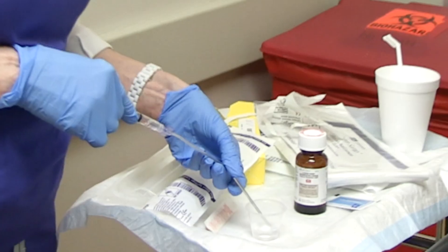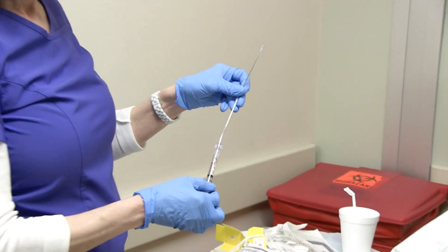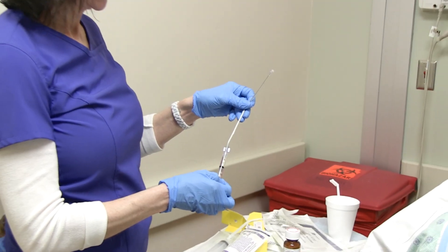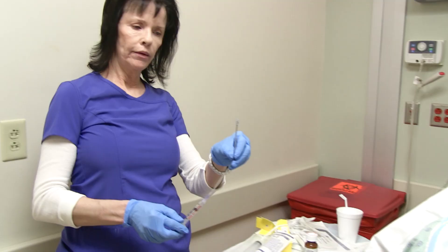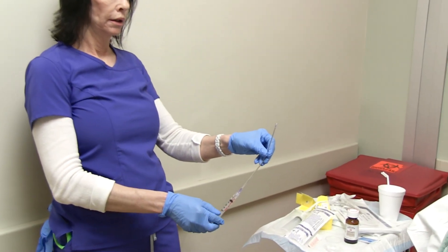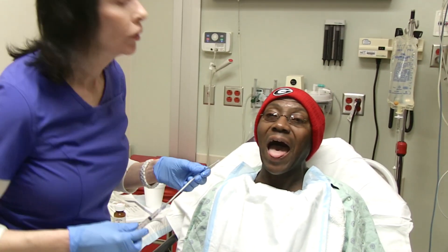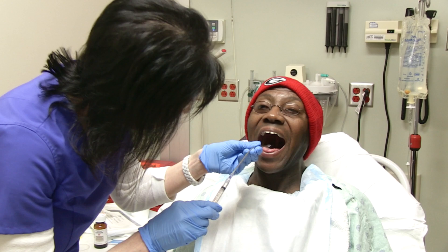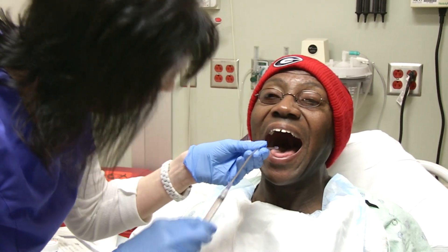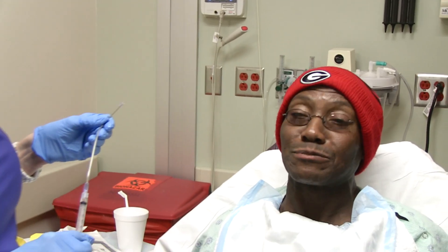It doesn't take but just a little bit. This is for his comfort and for mine. See how it sprays? Sprays just a little. So I'm going to put it in his mouth first. Just swallow this a little bit.